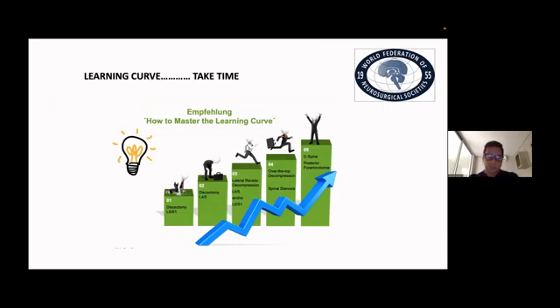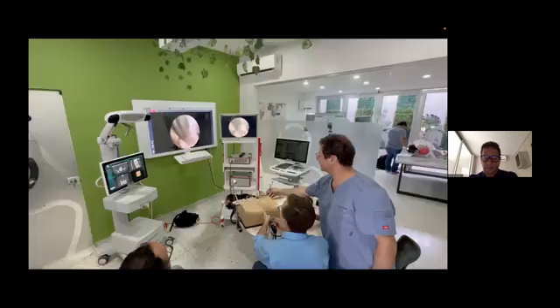Start with discectomy L5-S1, continue with discectomy L4-5. Afterward, you can perform lateral recess decompression, over-the-top decompression, spinal stenosis, severe spinal stenosis decompression, and at the end, you will be able to perform cervical surgery and combinations with other techniques like cages, implants, and so on.